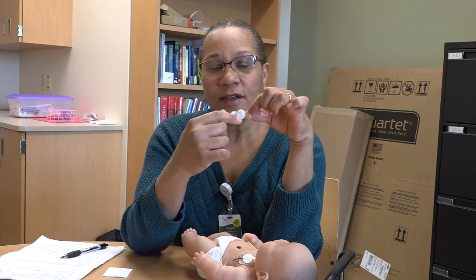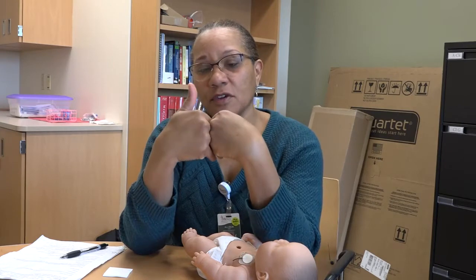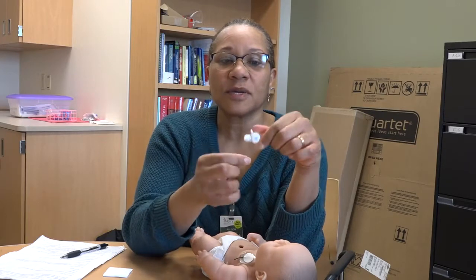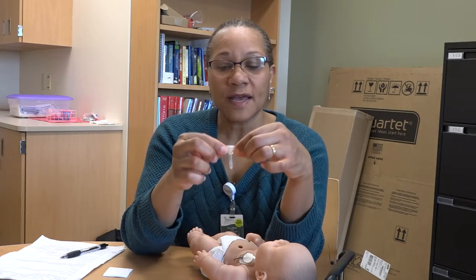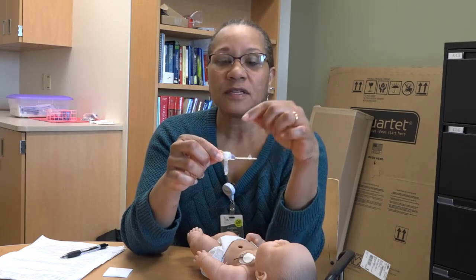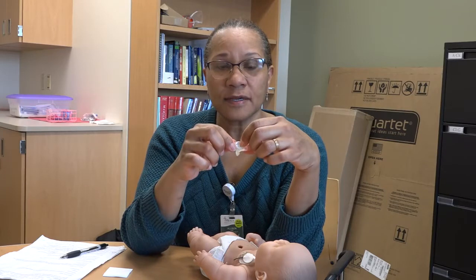By doing that, you remove some of the formula buildup, medicine buildup, so that those two pieces of the anti-reflux valve can remain flush and touching together. That's what keeps any gastric contents from coming back up through the hole and coming out of the tube itself. So that's the most important thing in taking care of the G-tube: making sure you flush after feedings and giving medication.